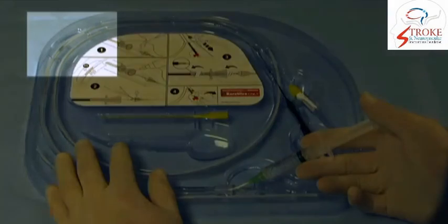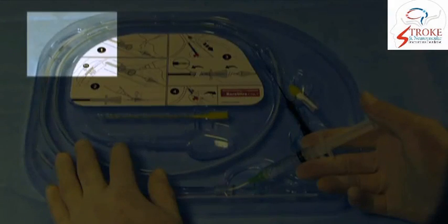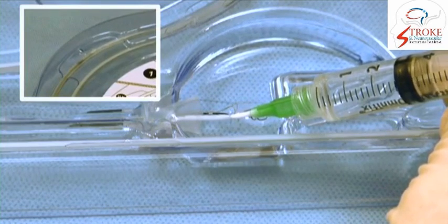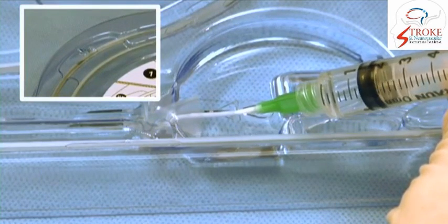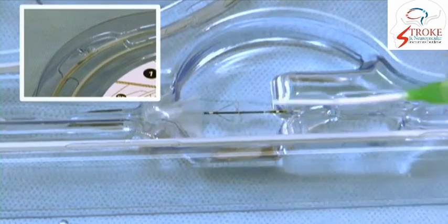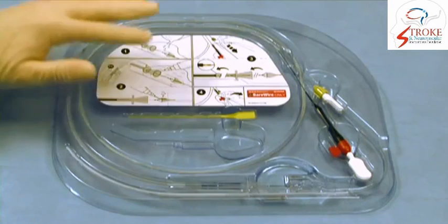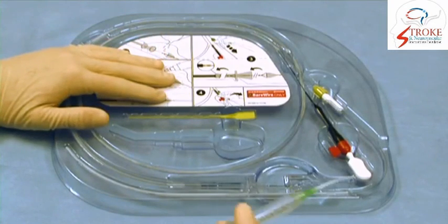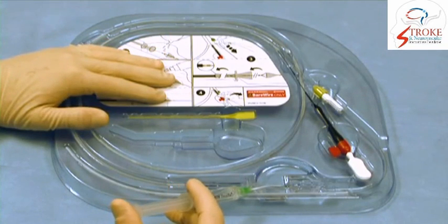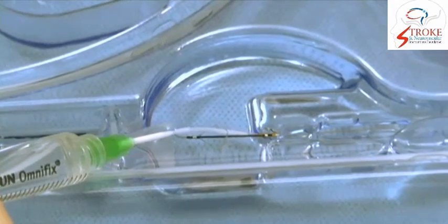What one can see here is saline dripping through the proximal port. The filter is also being flushed carefully, and you observe for any residual air bubbles in the filter.